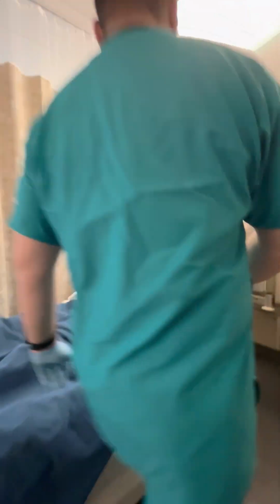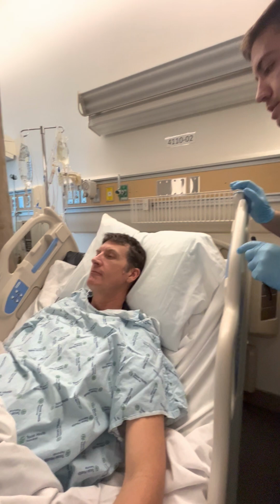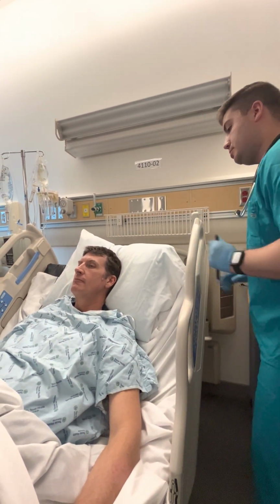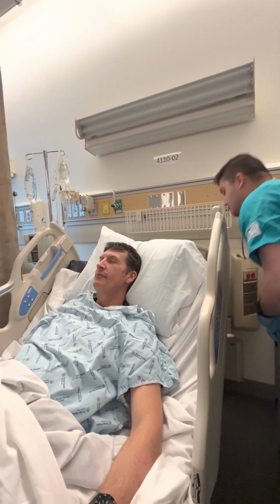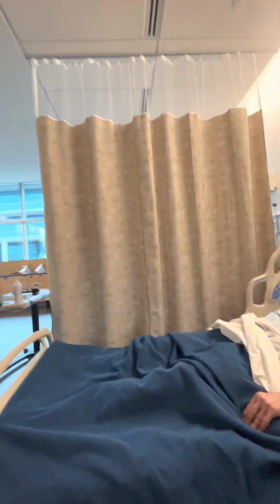Okay. I'm going to visually inspect the ear again. I'm going to shine a light. No drainage noted at this time. Symmetrical. Skin looks pink, warm, dry. I'm going to do the whisper test on the other side. Okay, sir? Yep. Good morning. All right. Perfect. Patient seems to be able to hear fine.